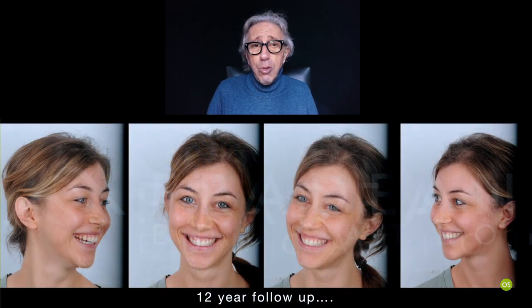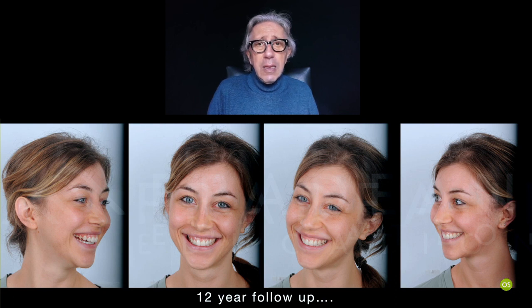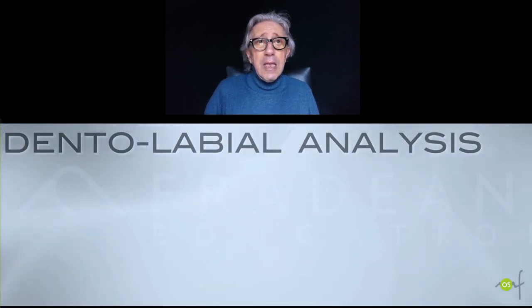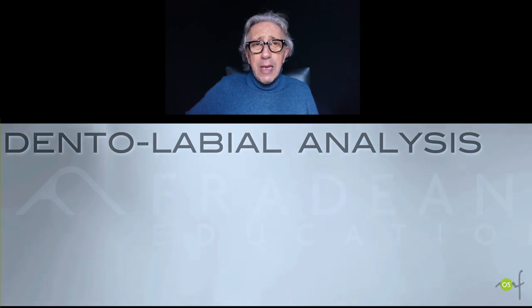The lady was improving the parallelism between the horizontal reference line and the orientation of the occlusal plane, especially the incisal plane, and we obtained a nice result that was also maintained over years. After 12 years in service, the patient still shows a very nice and harmonic relationship between all the parameters that we have in the face and the lips. Yes, lips, because you have to consider that another very important parameter is to understand that the dental labial parameters are to be followed.